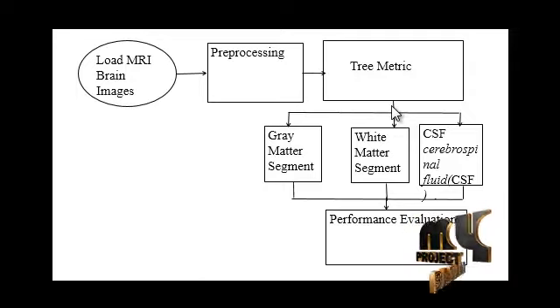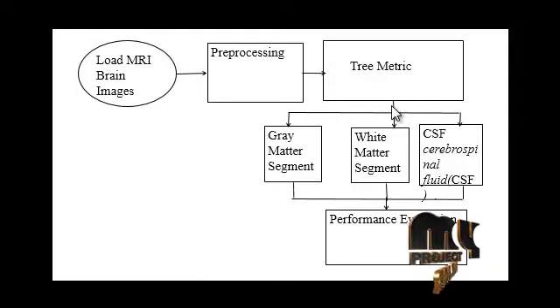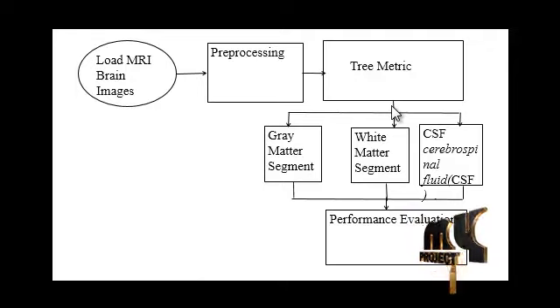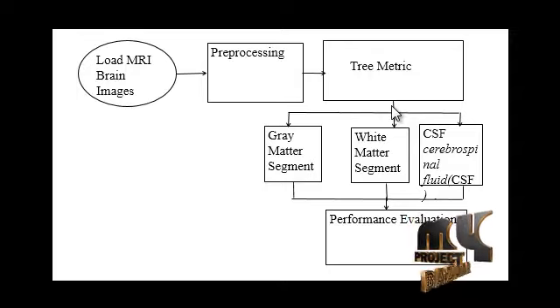Three stages of our TMTC algorithm are tree generation, sweep and pruning. Our first step is tree generation. We use agglomerative hierarchical clustering to create a tree of labels. In agglomerative hierarchical clustering, closest pairs of clusters in the feature space are repeatedly merged such that the distance between two clusters C and D reflects the increase in variance of the feature vectors in C union D relative to the variance in C and D.